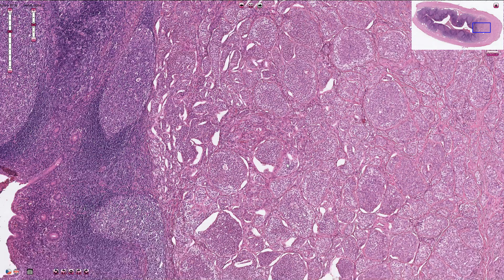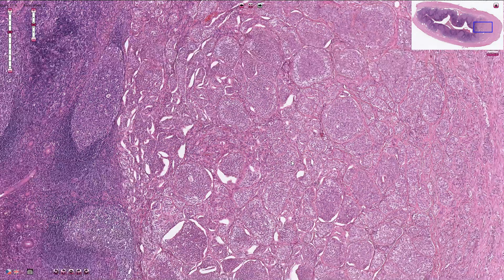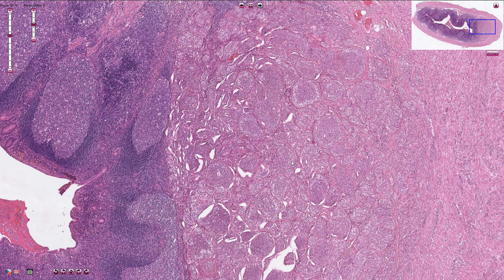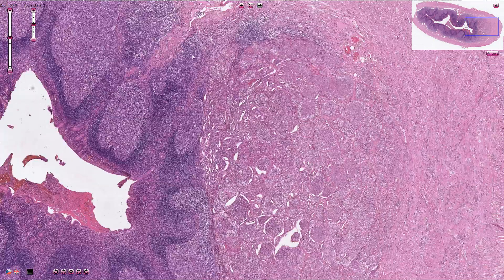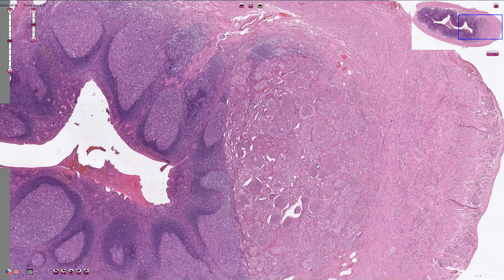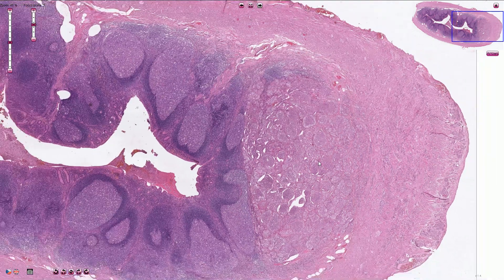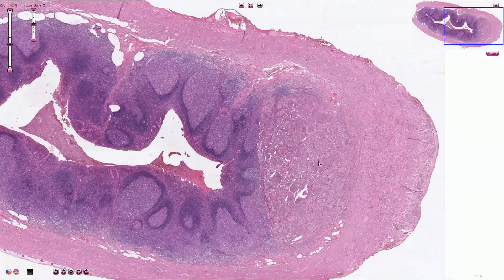The neuroendocrine tumor of the appendix is commonly an incidental finding, therefore it is necessary to submit a section of the tip of the appendix for all appendices removed for acute appendicitis.